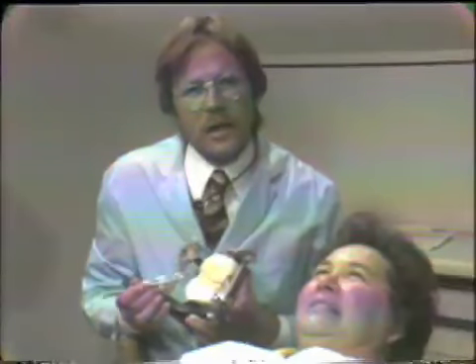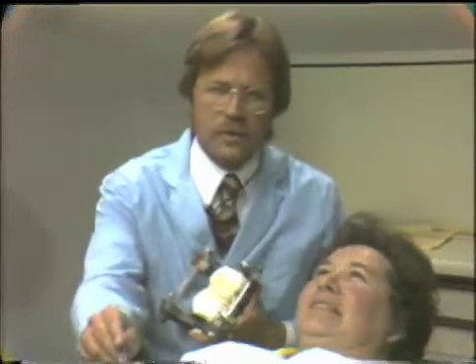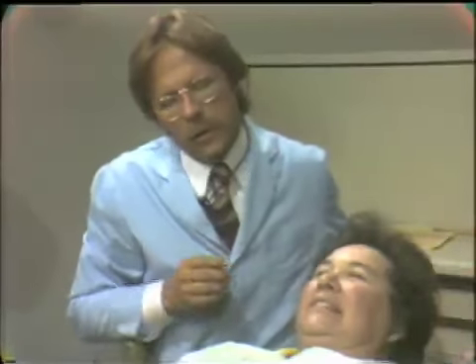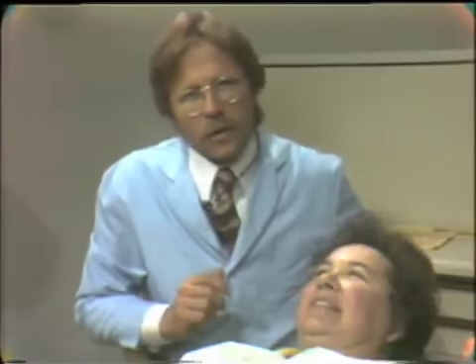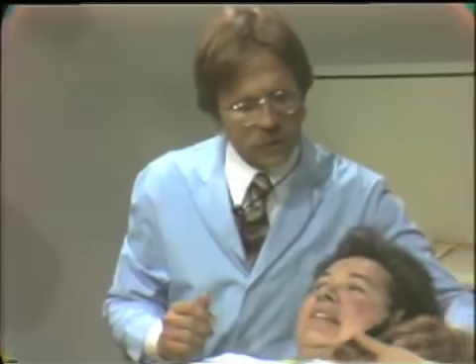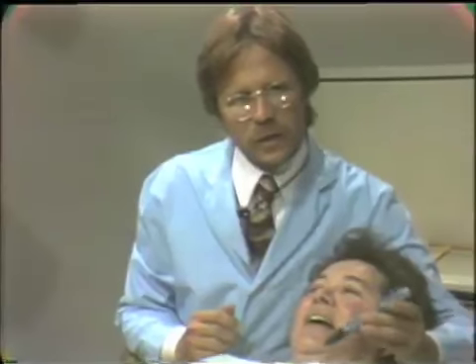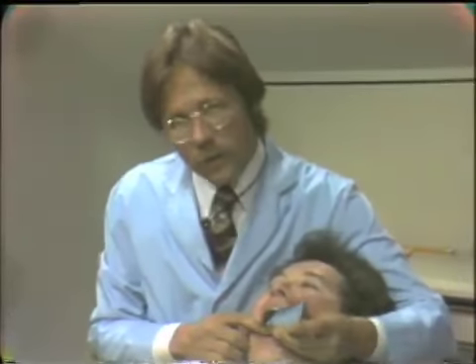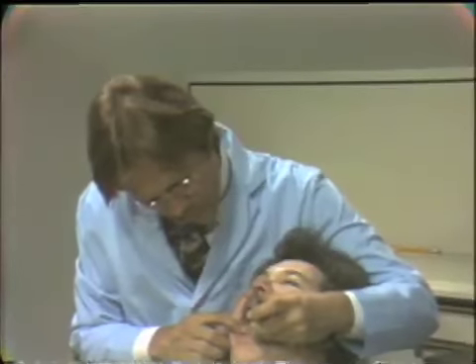In the same vein, we want to make sure that there is room for the framework of the removable partial denture, because we're going to be placing occlusal rests on the abutment teeth, and so we're going to look very specifically at the abutment teeth to see if there is enough room vertically for the framework.